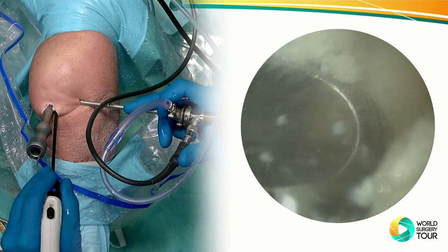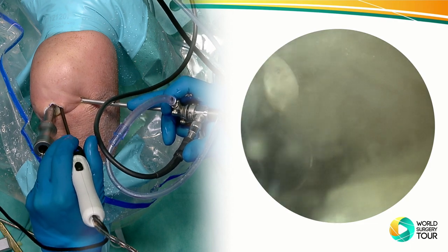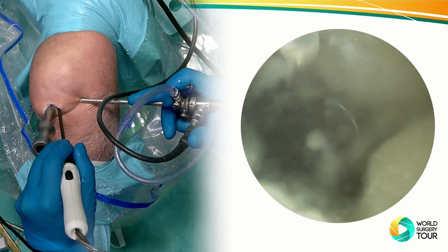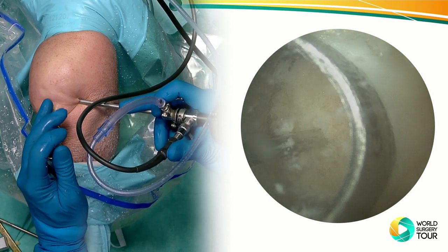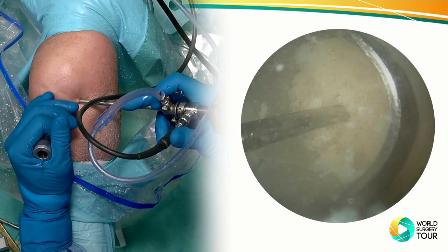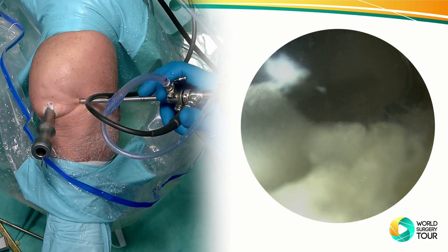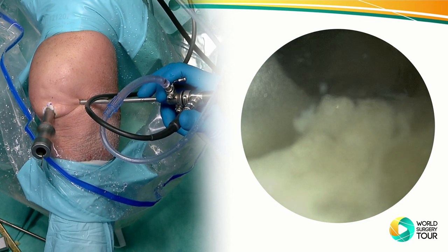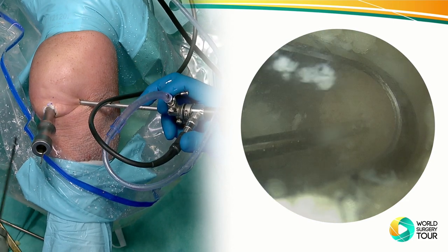Stephen, can you switch the suction on the device? Okay, that's it. Here we go. So you see, again, make sure that it really sticks. Good. So now we're going to remove the fluid. Stephen, again, the suction, please. I'm sorry, my mistake. Okay, here we go. Get the fluid out.